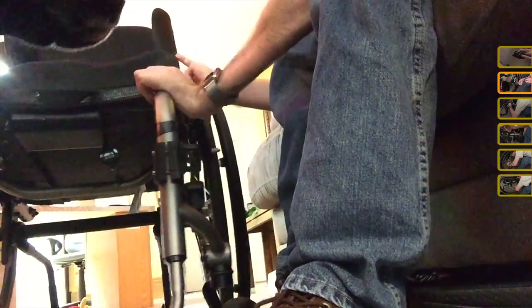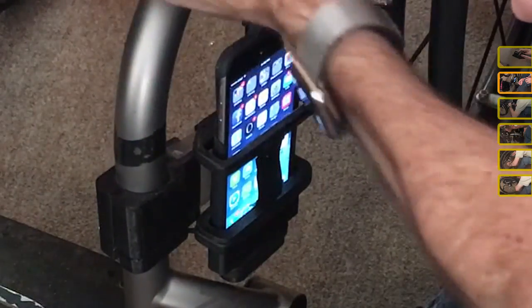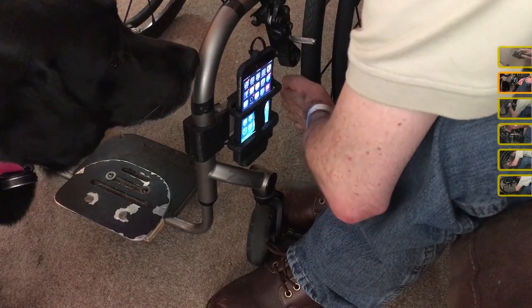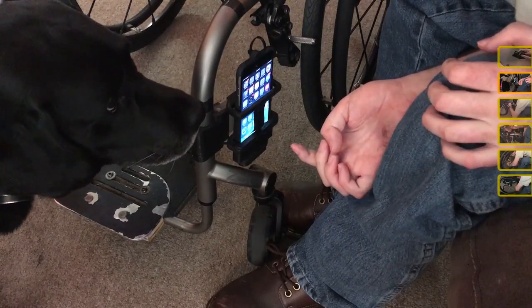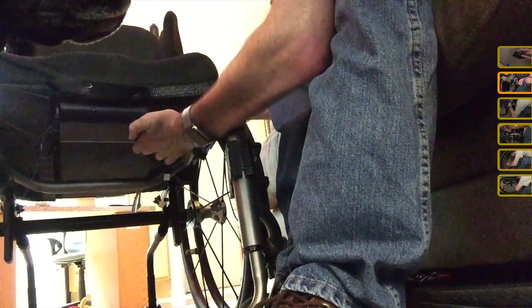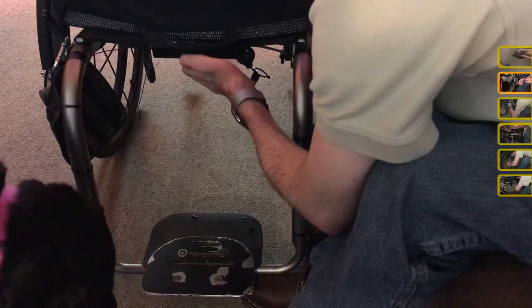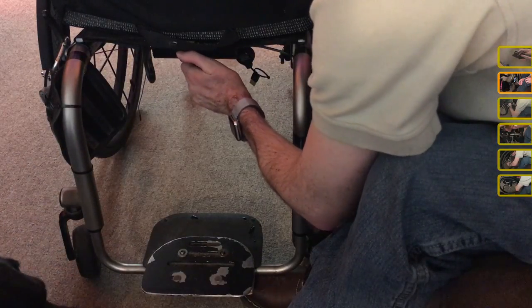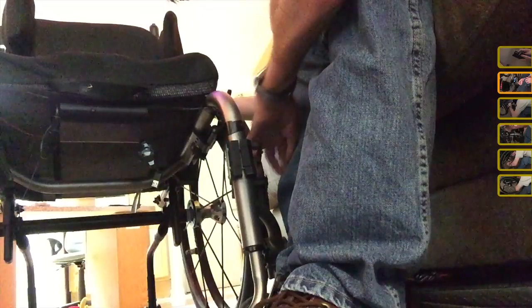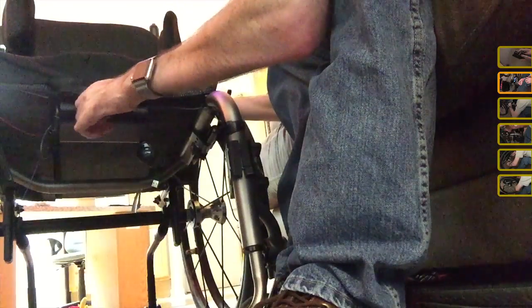in my chair. So basically, what I have set up on my wheelchair is my phone holder right here that I've got on a rubber hinge, so that when I hit things, which I always do when I transfer, it won't mess up my phone and it won't break the bracket. But this is actually wired through to a battery up here underneath, and this recharges. This is like one of the standard phone rechargers that you can buy at the Apple Store or wherever, that when your battery's dead, you can plug in and boost it. But I've got that set up with my phone holder here. So if my battery's running low, I can just put my phone in there and hit this button, and it'll start charging.